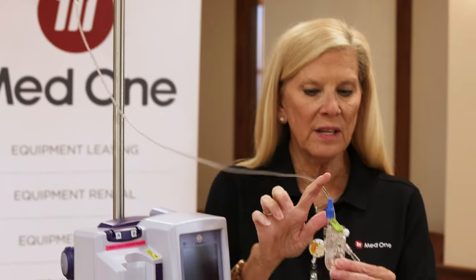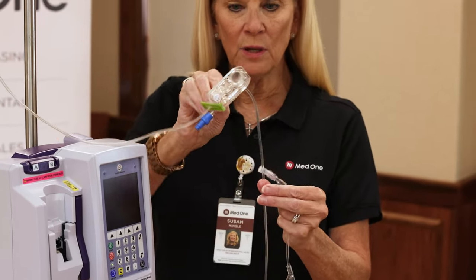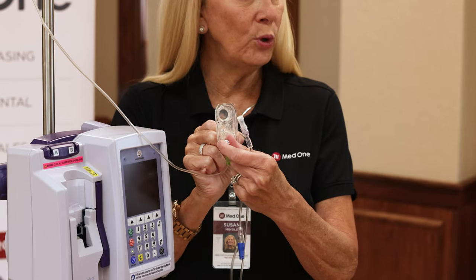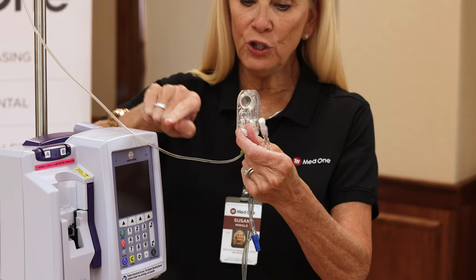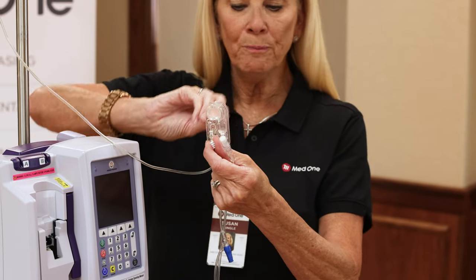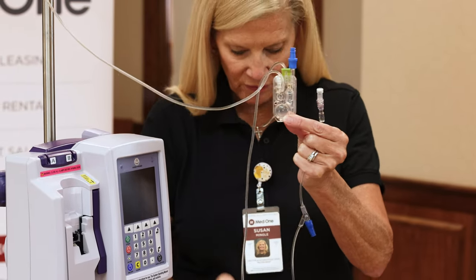Moving down to the cassette, you'll see there is also a clave here. When priming the tubing, you want to invert that clave so it's basically upside down. This knob is called the flow regulator — pull it out to start priming. Priming will slowly move down the tubing and into the cassette. Once it fills the round portion called the air trap, invert the clave again so it's in the upright position.